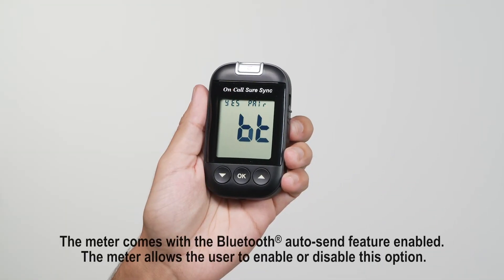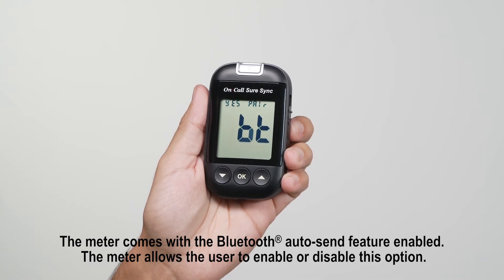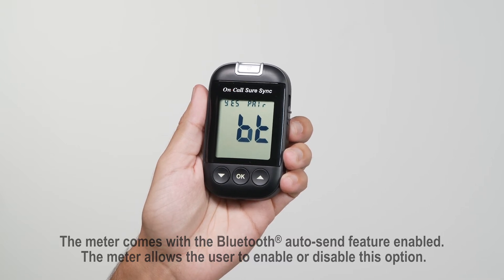Prior to pairing your glucose meter and mobile device, you will need a mobile application on your mobile device to accept the meter's information and data. Consult your local distributor for current mobile app compatibility.